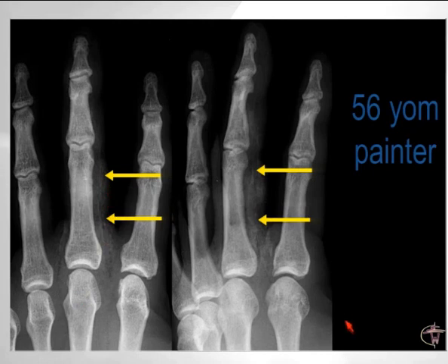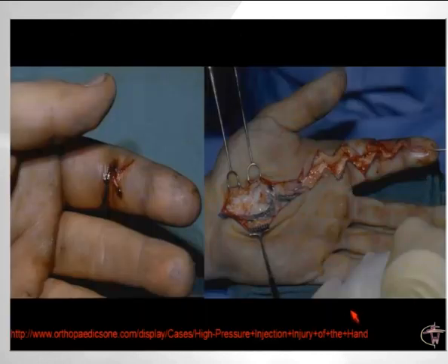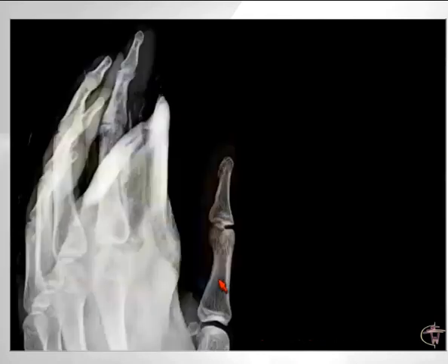be tiny and small. Here's another example, very small skin defect, but when the debridement is performed, you have a long incision ranging from the fingertip all the way back to the wrist. This is the full extent where the exploration has to occur.